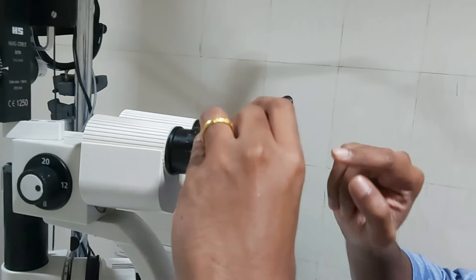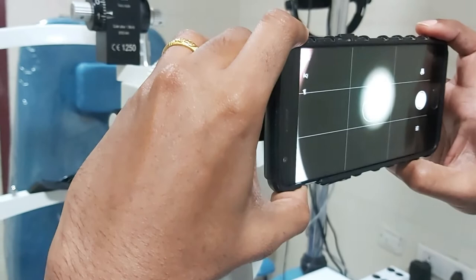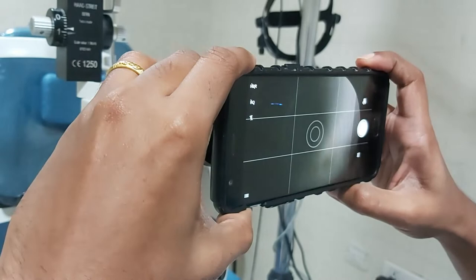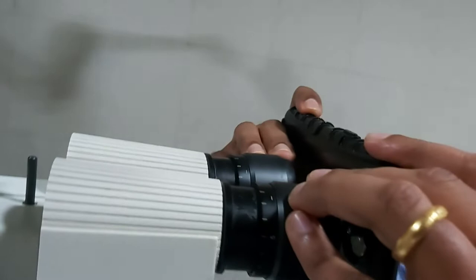Make sure that the flash is off and adjust so that you can see a sharp circle. This is a blurred circle, and this is also a blurred circle. But if you come to the correct distance you get the sharp circle. You can see here the correct distance to hold the camera from the eyepiece to get that sharp circle.